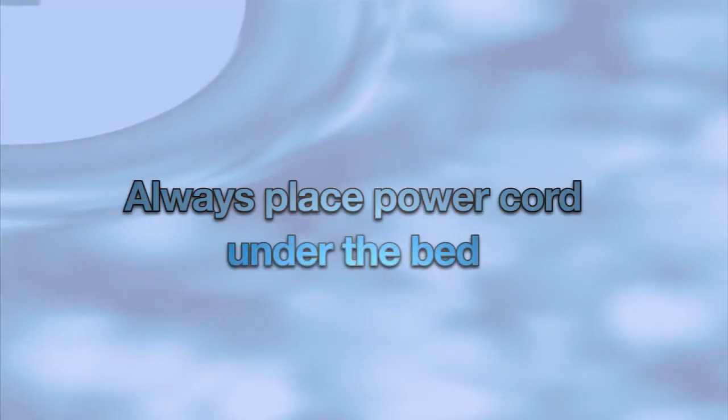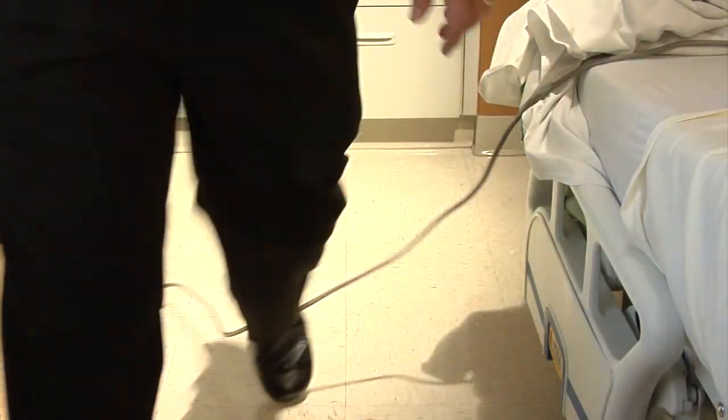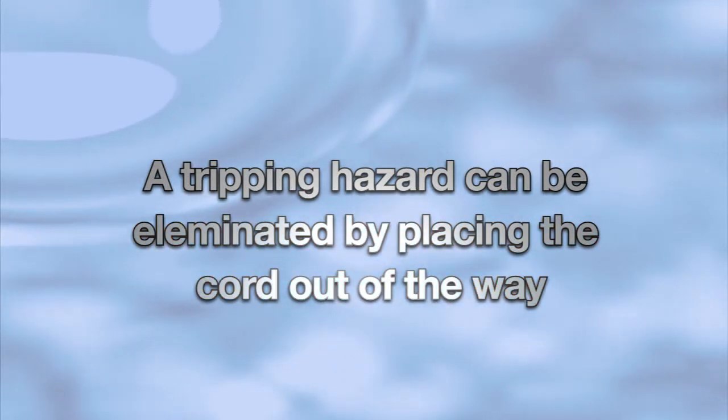To keep our friends at the Joint Commission happy, we need to touch upon a few safety items. CPM machines generally come with a long cord. When possible, this cord should be placed under the bed. If it cannot be placed under the bed, you must make sure that it's out of the way of foot traffic. A tripping hazard can be eliminated by carefully placing the cord out of the way.